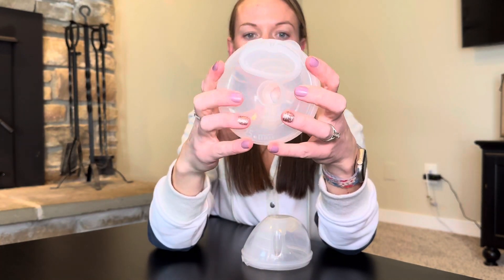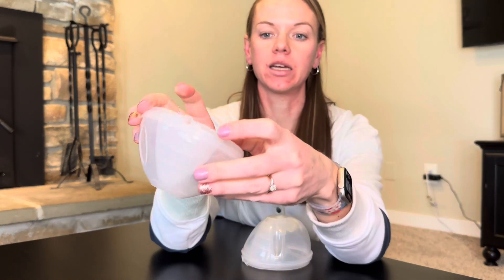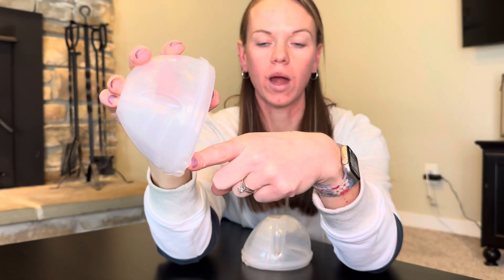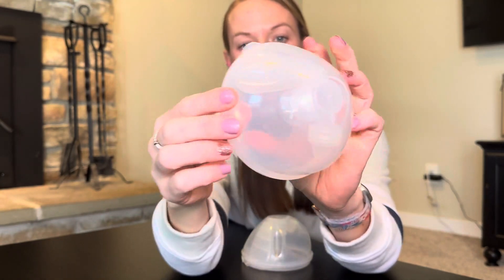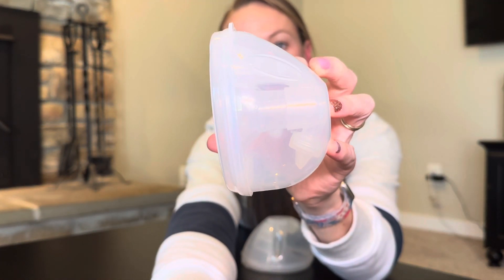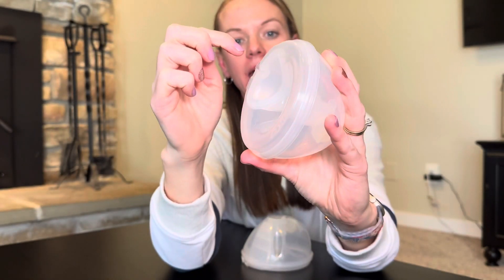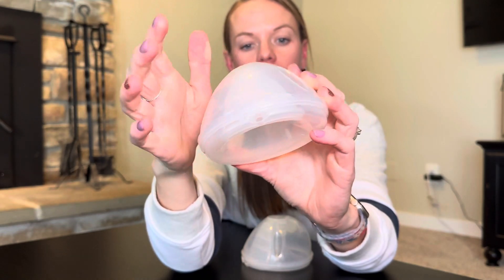It clips together really nicely. Now this holds 8 ounces, which is a pretty significant amount. It does have the little pouring top. So this is the only part that's open — this little piece right here on the top where you can actually pour the milk out. It does have measuring on the side, which is nice. And then you just connect the tubing right here on top as well. So everything's on the top.